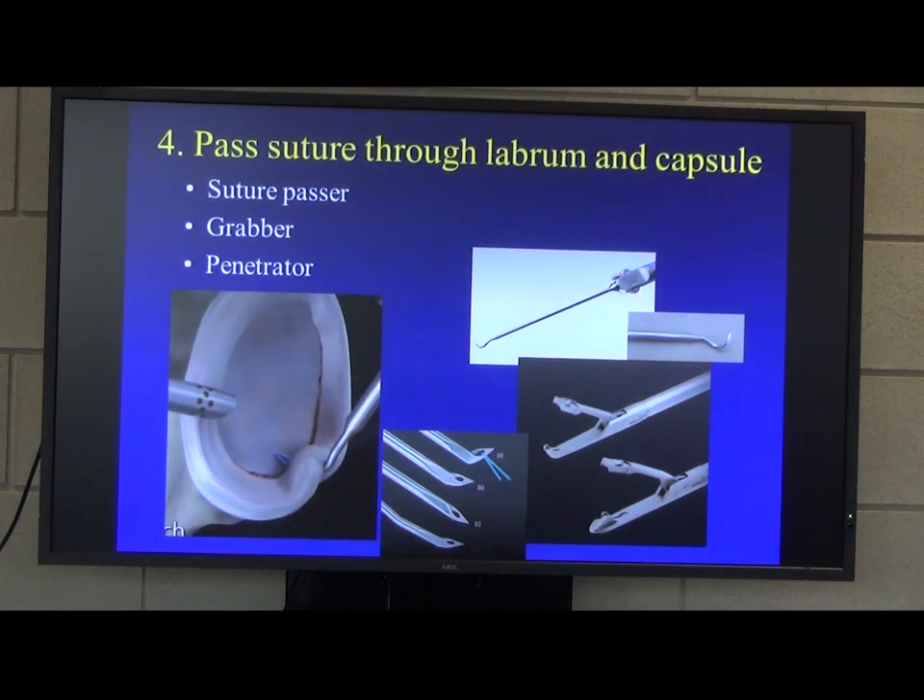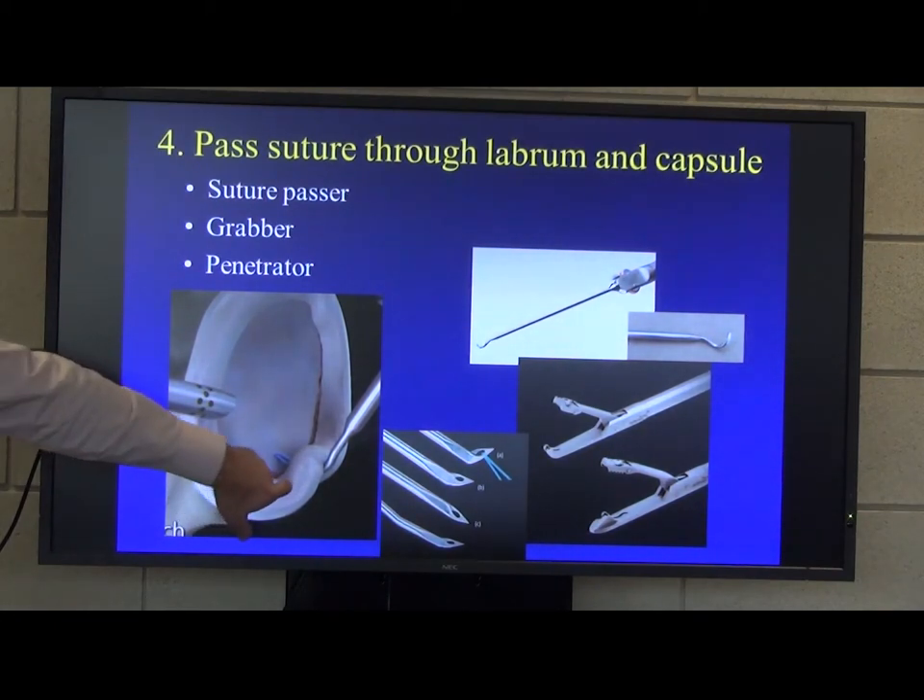You then have to pass a suture through the labrum and the capsule. There are basically three different types of instruments for doing that: a suture passer, something called an Acupass or the Spectrum from Conmed — essentially a little curved cannulated needle. You need to get behind the labrum but also pick up quite a lot of the capsule as well. There are also graspers where you slide jaws between the labrum and capsule to grab the tissue and pass the suture through, or penetrators such as the BirdBeak, which you push the suture through the tissue.